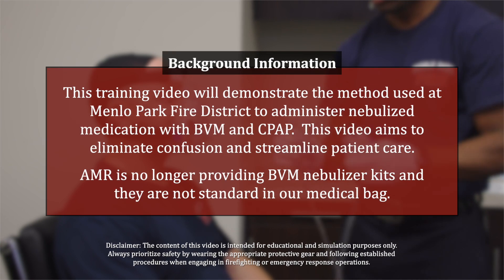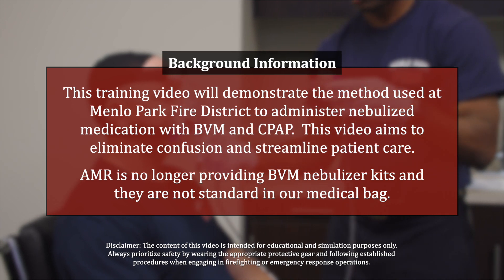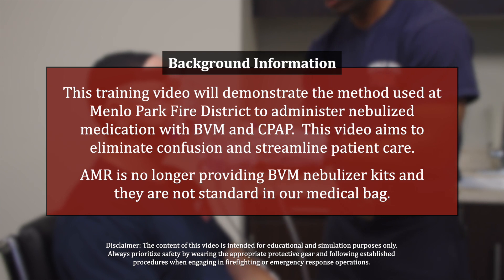This training video will demonstrate the method used at Menlo Park Fire Protection District to administer nebulized medication with BVM and CPAP. This video aims to eliminate confusion and streamline patient care.